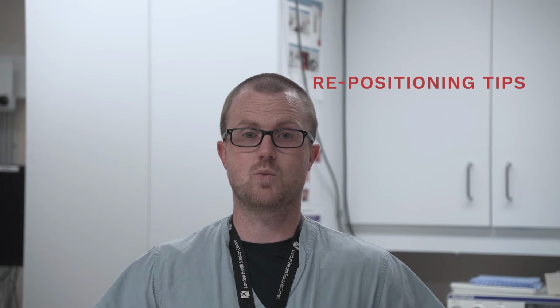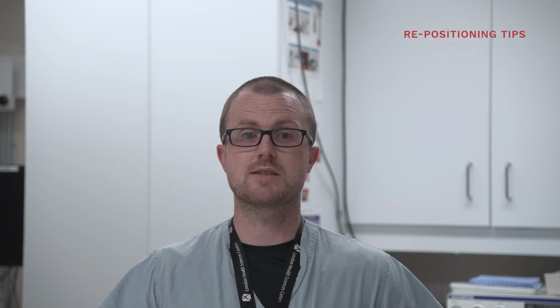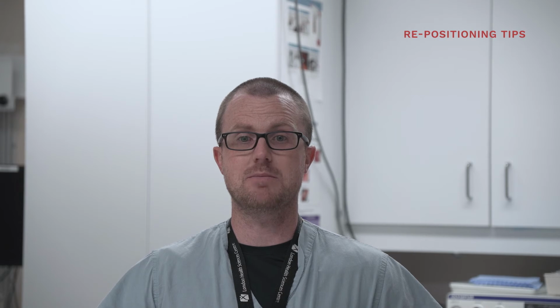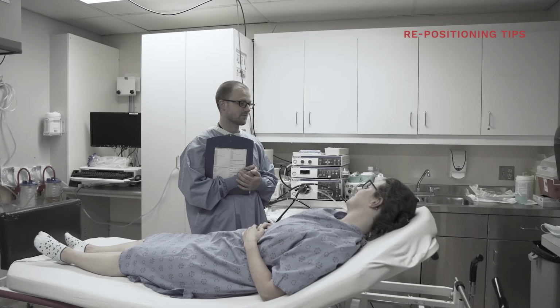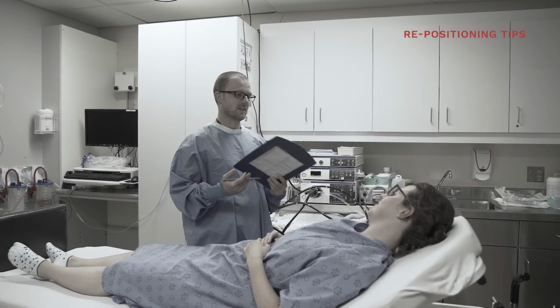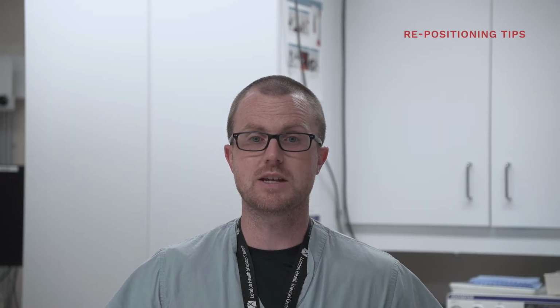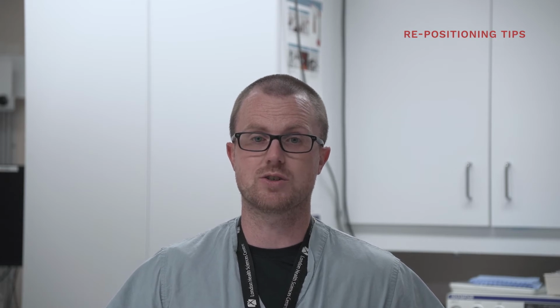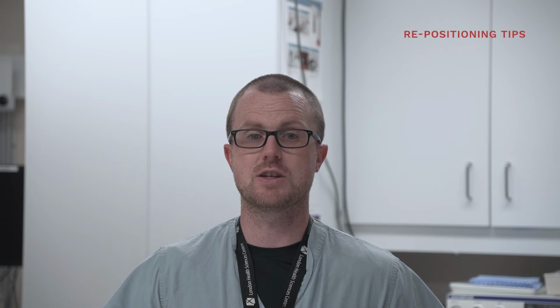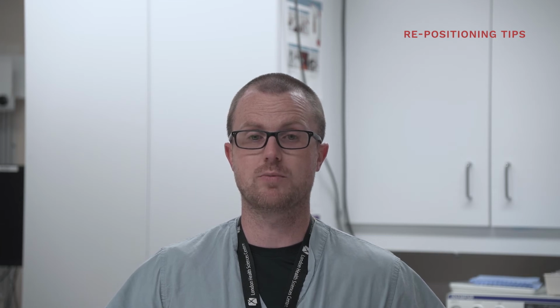Repositioning your patient while maintaining your scope position is a skill unto itself, but can be done efficiently when the tips shown here are followed. Repositioning the patient is of course easiest with either a minimally or unsedated patient who is able to cooperate and move themselves with appropriate instruction. If deeper sedation is being used, a slider pad may be helpful.